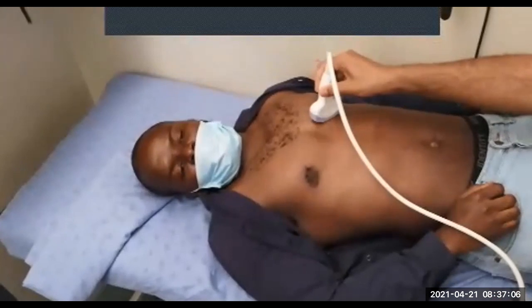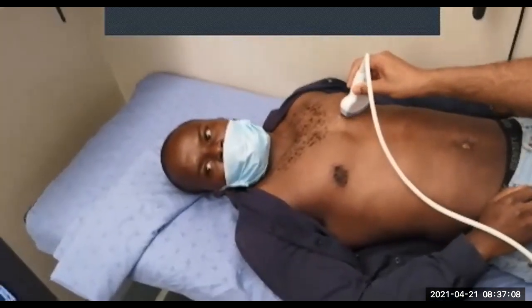So let's come out of motion mode. We've had a look at his heart in 2 planes. Now, let's say we couldn't see the ventricles properly for whatever reason. Let's say there were rib shadows or something like that, passing across like this. Let's say somebody's got very close ribs. Then what we can do is something called the short axis.